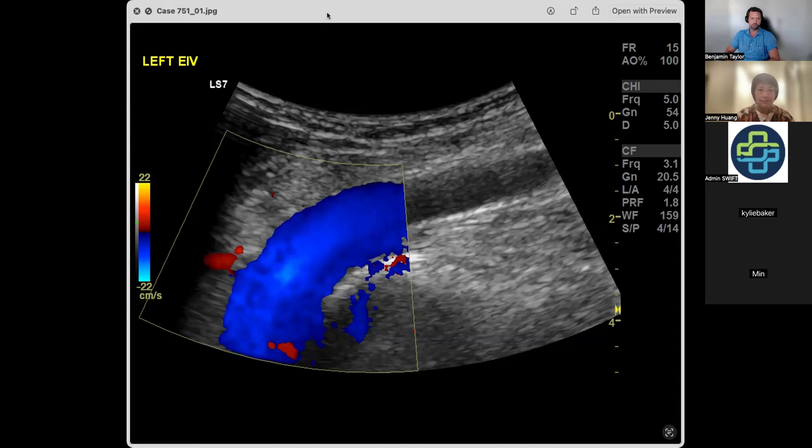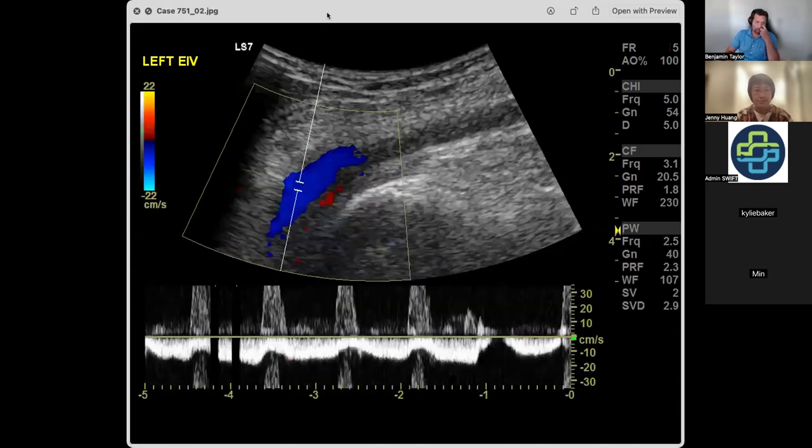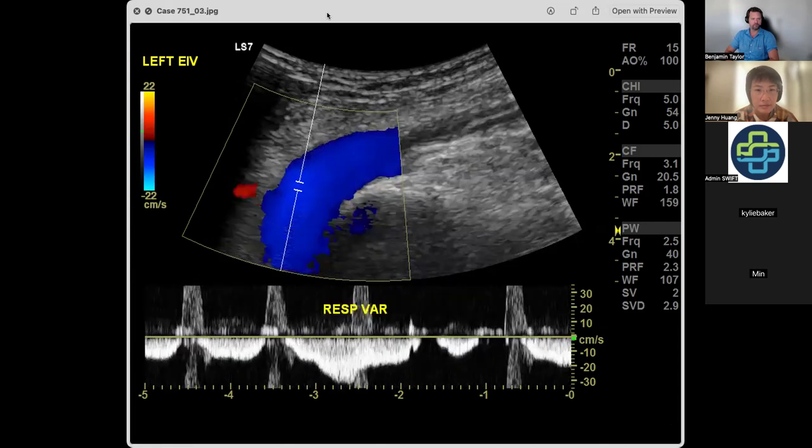Okay. So let's go back. This is coming onto our dynamic maneuvers. And I've got that one there. Ignoring the little arterial trace that I've picked up because of a bit of beam width and beam thickness artifact, what are we looking for there, and why do we do this bit?